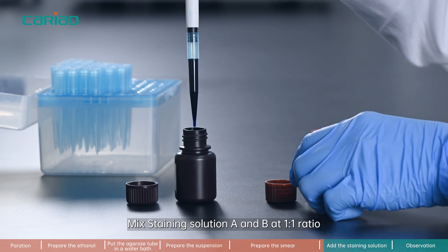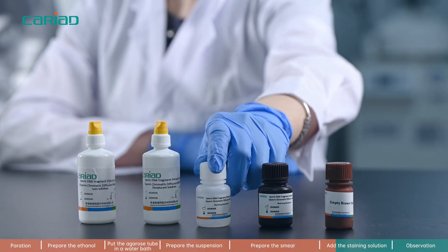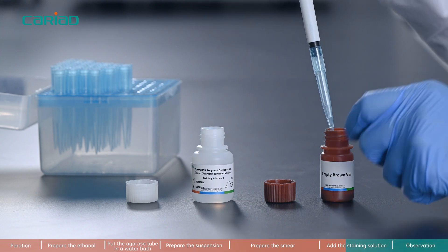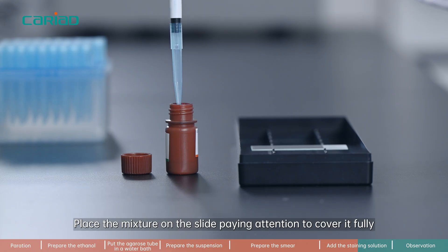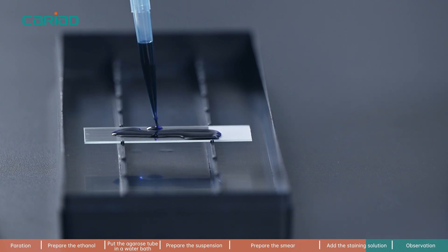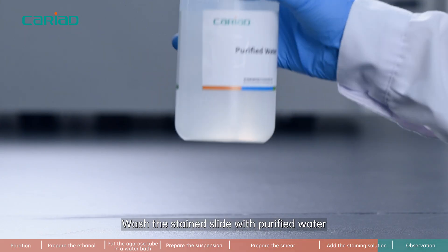Step 9. Mix staining solution A and B at a 1 to 1 ratio. Place the mixture on the slide, paying attention to cover it fully. Wait 3 minutes for staining to occur. Then wash the stained slide with purified water.